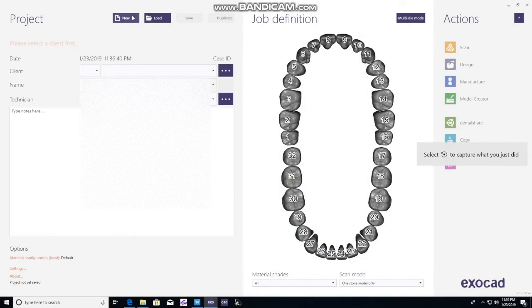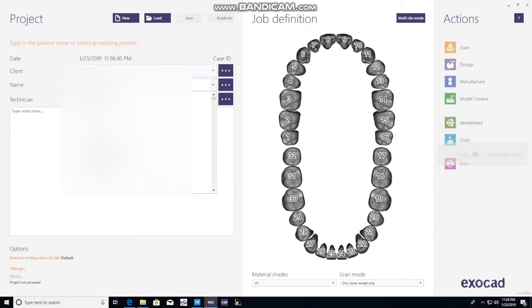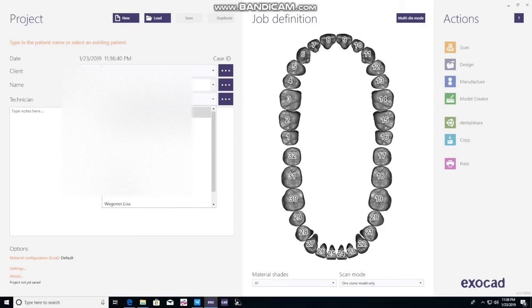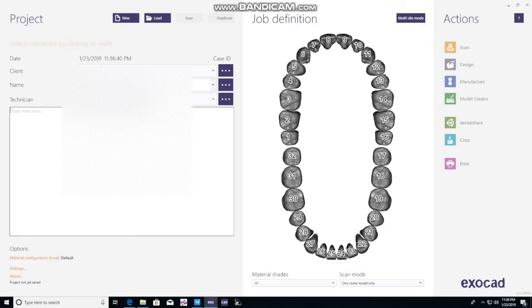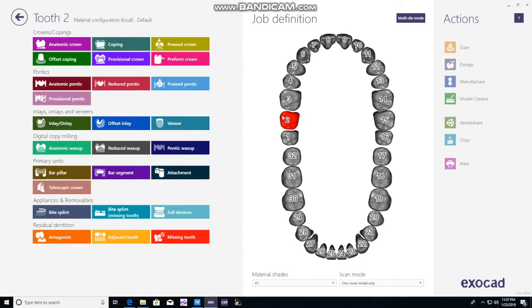We're going to show you how to design an occlusal night guard using ExoCAD software. These are the basic steps. Entering the lab, we're going to use the patient's name and the technician. The notes window below — you'll give a brief description of what you're actually doing, in this case a night guard. Then you'll program it and tell it what it needs to do, and that's done by the tooth chart.